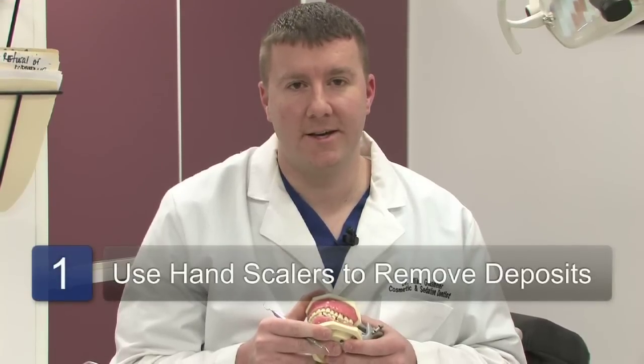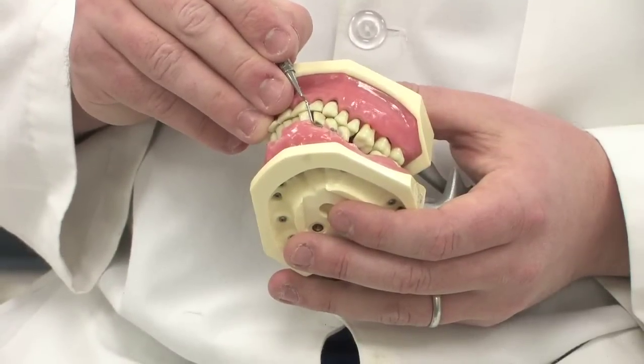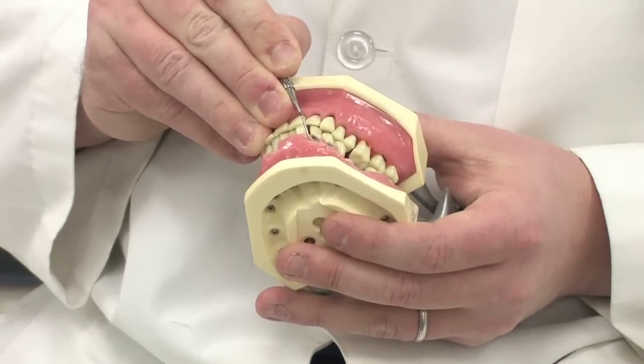The first step in removing the calculus deposits or calcium is to use hand instruments, also known as scalers or sickles. Using a combination of these instruments, we can gently scrape around the gum line to remove some of the calcium deposits that have accumulated around the teeth.